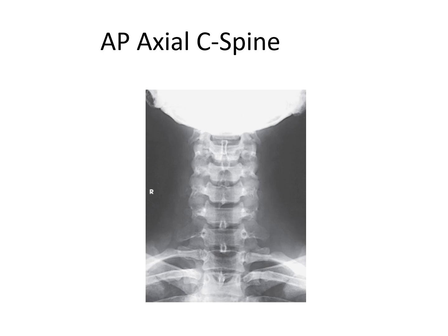Now we can count these out. You can see the ribs coming off of the second one from the bottom. So that's got to be what? If it's got a rib coming off of it, isn't that T1? We're going to assume that cervical ribs don't exist. It's not a genetic variant. So we're going to call that T1. The next one up would be C7, then 6, then 5, then 4, then 3. And it looks like we're clipping. We got the bottom half of 2.